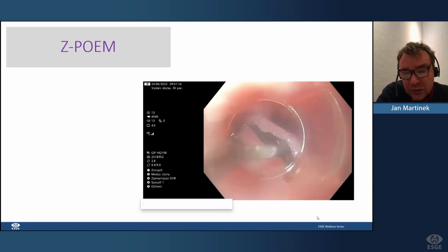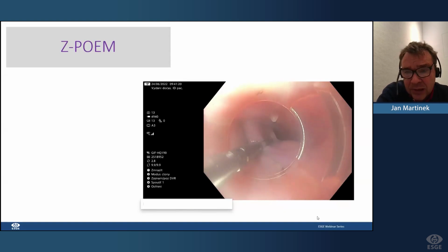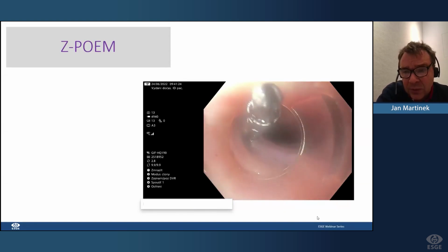At first look, this muscle looks like one mass, but these muscles always split into two. At the end, we can clip the incision, which is quite easy if we perform the incision above the septum.